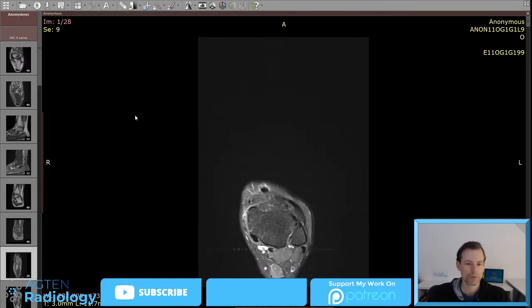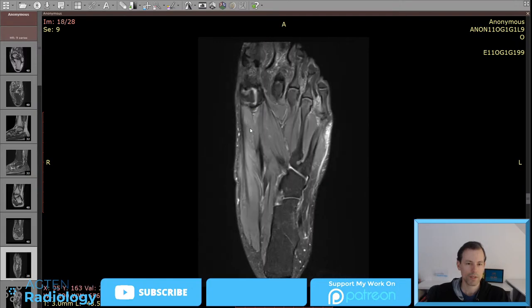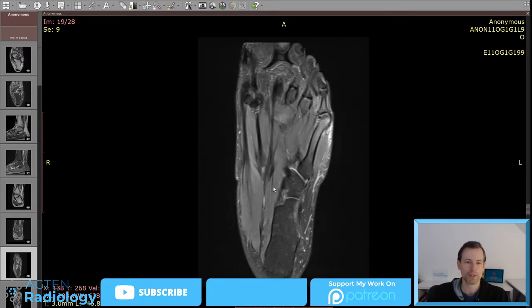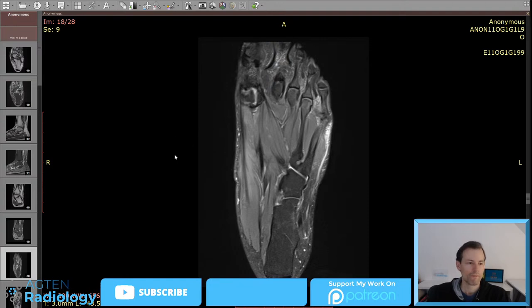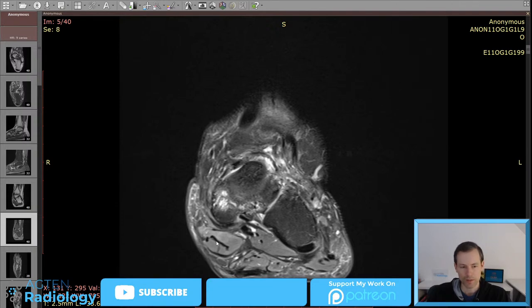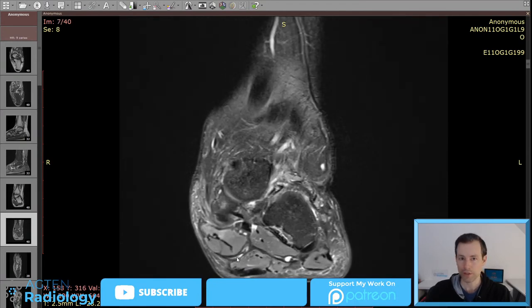And if we go to the larger field of view, even here in the flexor hallucis brevis, in the most distal portion, there might be somewhere else. We can also see in the flexor digitorum brevis some edema. Now, why does the patient have edema there? There are a few differential diagnoses that we can discuss. Maybe because he has this trauma and everything, maybe it's mechanically induced, maybe he's walking differently, maybe he needs more muscle activity to maintain his function, and it could be something like delayed onset muscle soreness from recent activity, for example. And the question is always, with edema, could it be denervation, right?